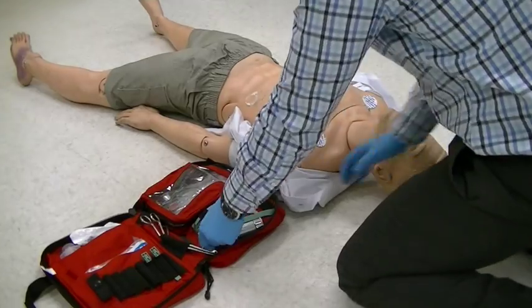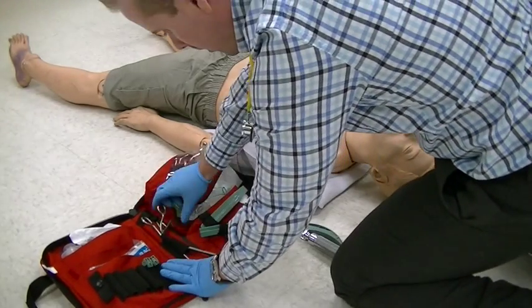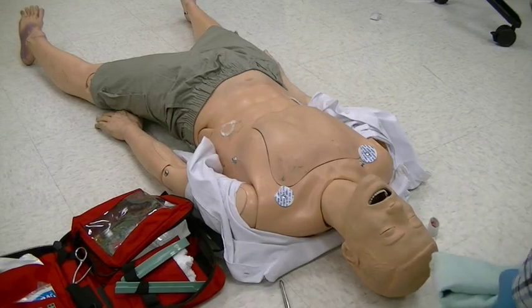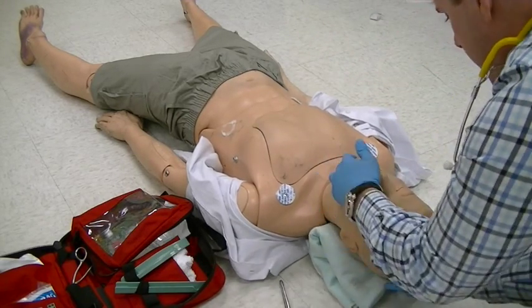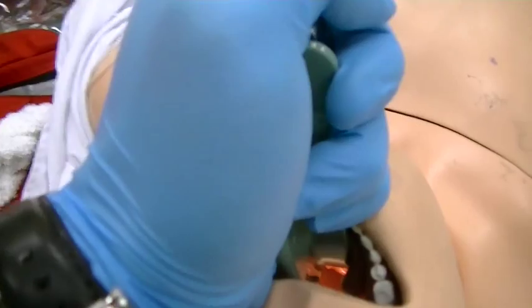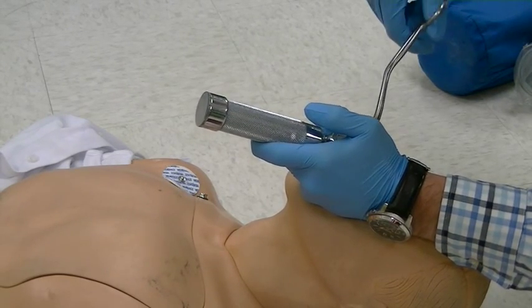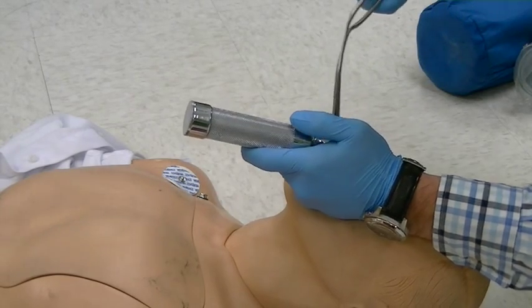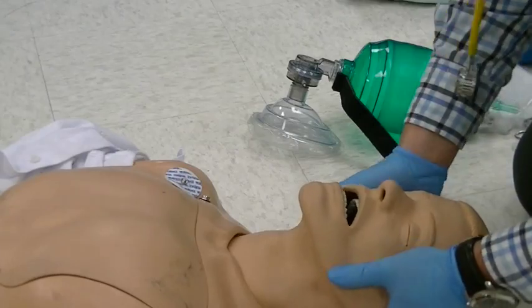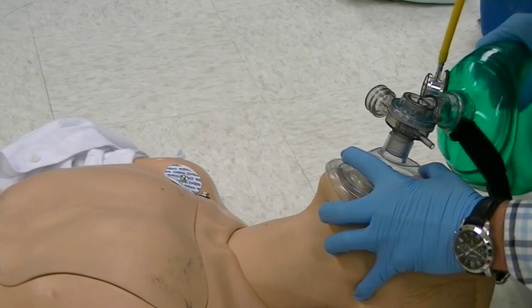Identify and select the appropriate equipment. Ensure your laryngoscope light is bright and secure. Place the patient's head in a sniffing position and insert the laryngoscope into the vallecula. Visualize the obstruction. Insert McGill forceps in a closed position, grasp the object with the McGill forceps, and remove the obstruction. Observe for return of spontaneous respirations for 5 seconds. If respirations do not resume, begin ventilation with a BVM.